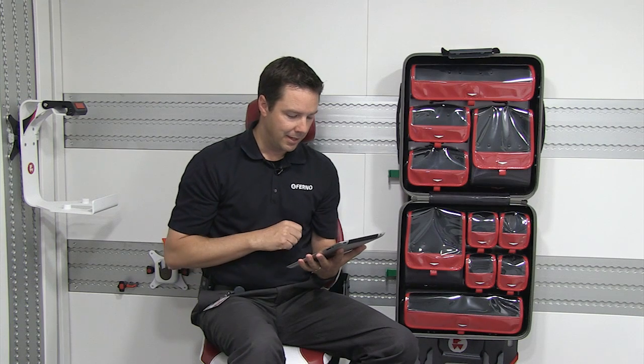And you know, if we keep the equipment from flying in an accident, but we don't keep a medic from flying in an accident, then we've kind of wasted our time. So what we're trying to do is give the medic as much of an opportunity to stay seatbelted and restrained as possible by putting things within reach. So hopefully that answers that question.